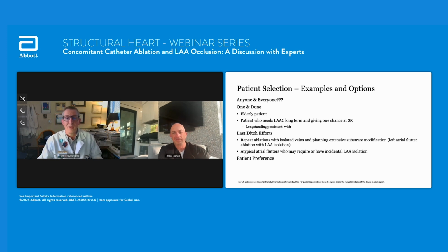I know I saw at AF Symposium several folks doing the isolation prior to putting an Amulet or a Watchman in, and it certainly works well. It cups the ostium of the appendage pretty well, right? Or you can do it, I guess, in a basket if you need. But yeah, absolutely.